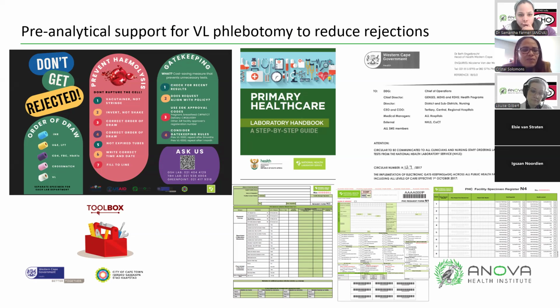When we say don't get rejected, what are the elements that can contribute to low rejections or no rejections? One of the things that we get a lot is preventing hemolysis, so there are just a few steps. Then gatekeeping, which is really what we're struggling with. And then the order of draw can also contribute.